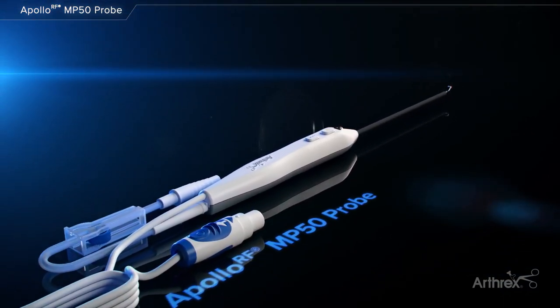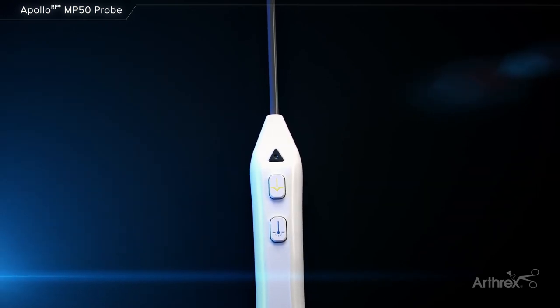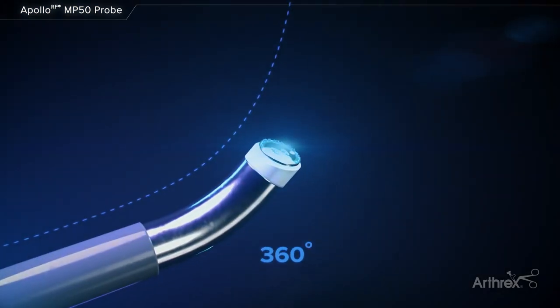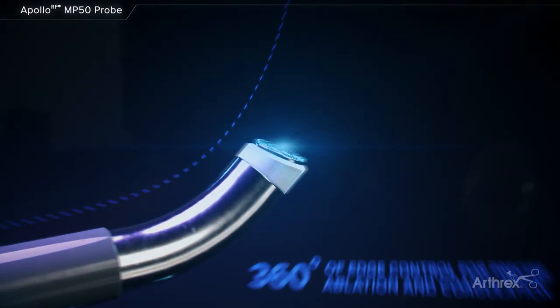The Apollo RF MP50 probe is designed specifically for knee arthroscopy. The probe has a reduced energy default and 360 degrees of edge ablation to precisely sculpt tissues in arthroscopic procedures.